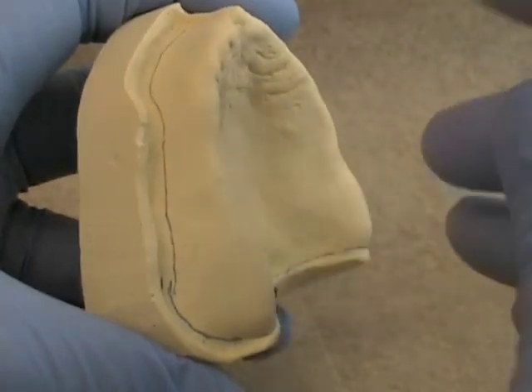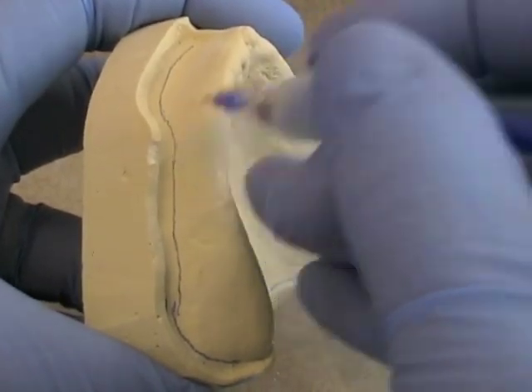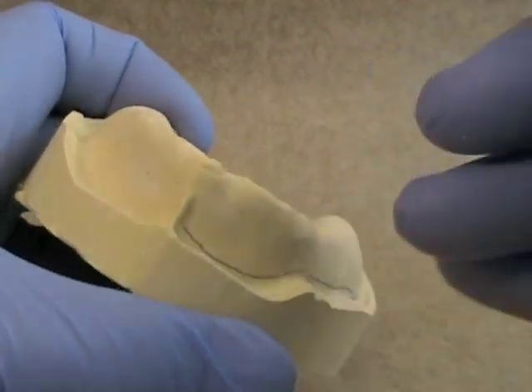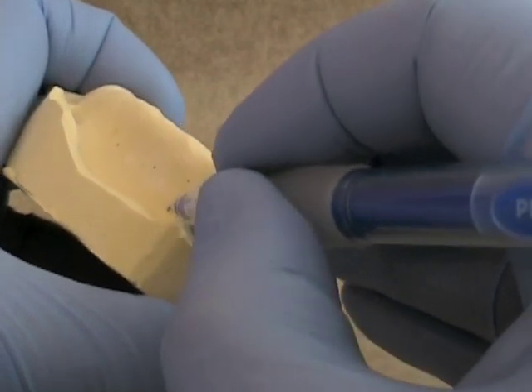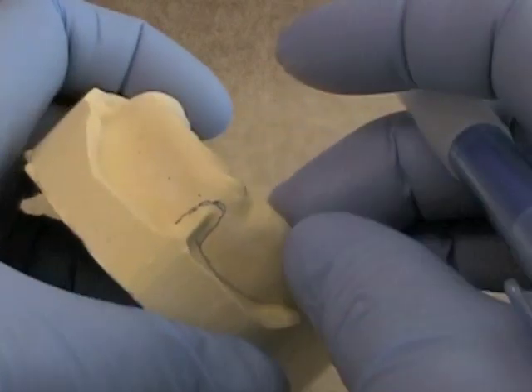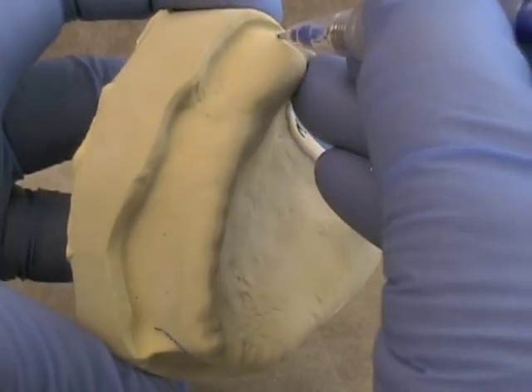You don't want it too far away from the tissue, and you also want to make sure that you give some room where there are frenal attachments in the area. In particular, in the labial frenum, it's important to make sure we go all the way up and around to provide enough relief for that frenum so that the very top of the frenum is not compressed by the tray or eventually by the denture.